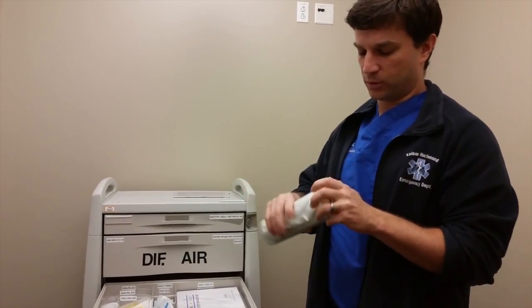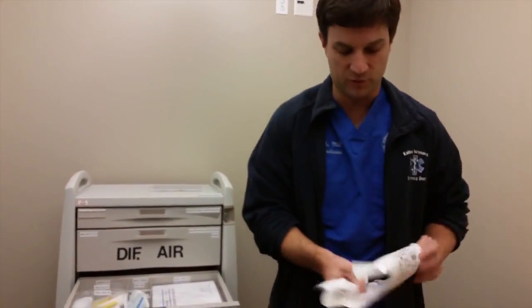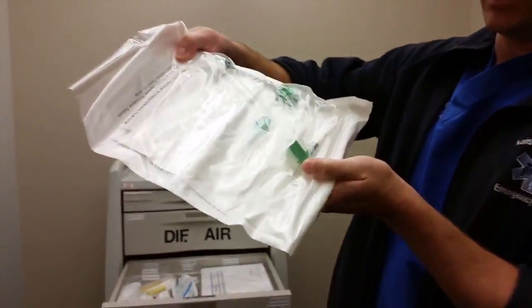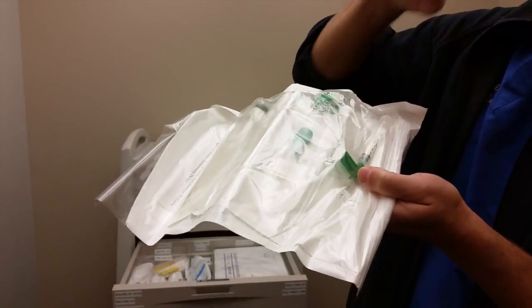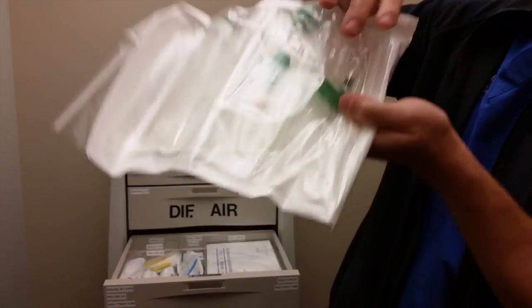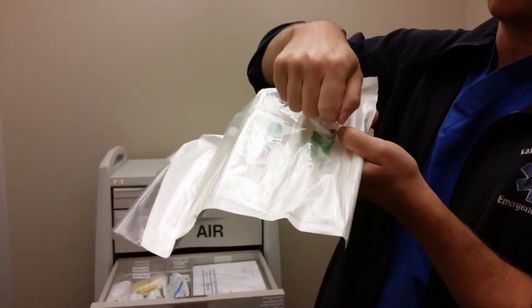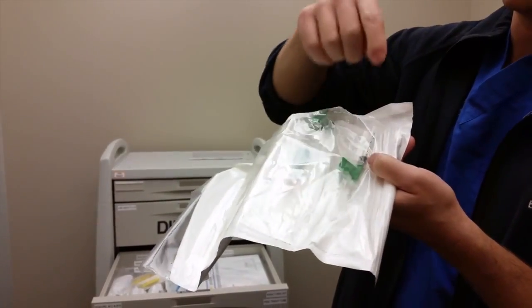And the way the PercTrach works is it's a percutaneous approach as opposed to a surgical approach, where you would use a needle, you put the needle in, and then you have a little dilator and guide wire combination that goes in. The needle is a breakaway needle, so you squeeze these two green ends together, the needle breaks in half as you're putting your dilator and guide wire into the trachea.